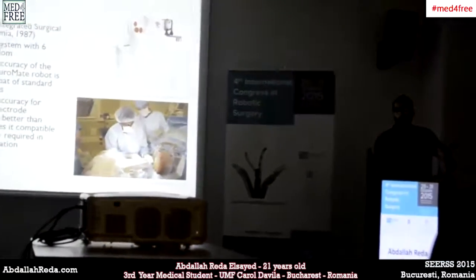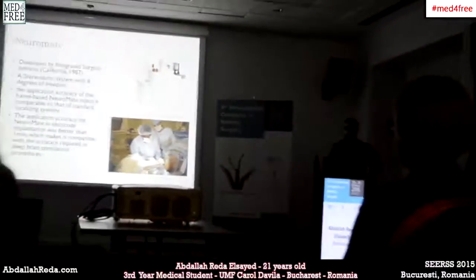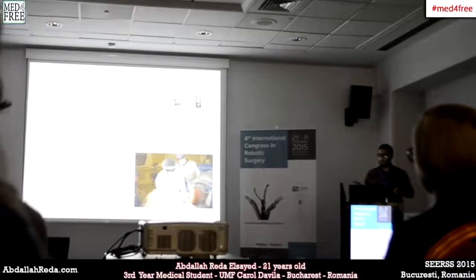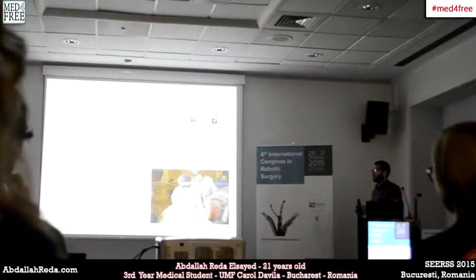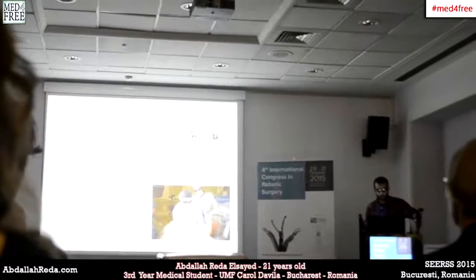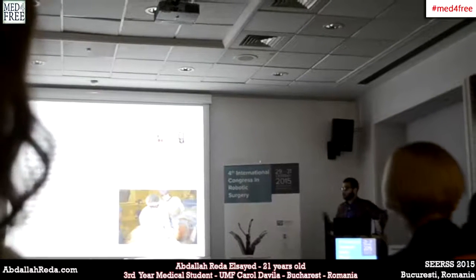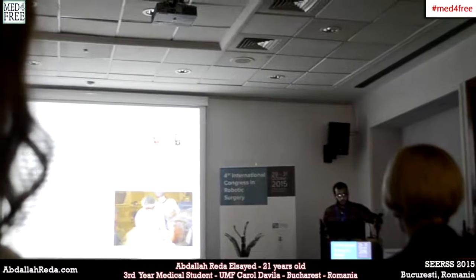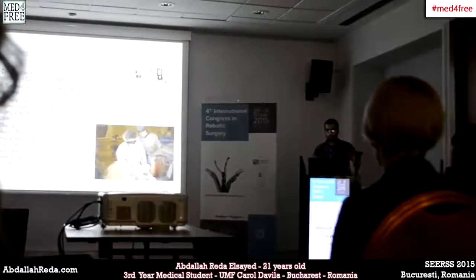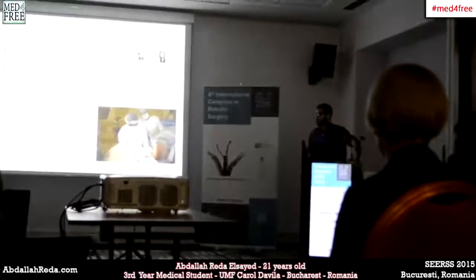So I'd like to start with Neuromate, which was developed in California in 1987, which is pretty interesting. So it's not pretty recent. Since the peak of the advancement in robotics, that idea came to mind, to use robotics in such a very precise operation. It's a stereotactic system with 6 degrees of freedom, and it's pretty interesting because the frame-based Neuromate robot's preciseness is comparable to that of standard localizing systems, and the application accuracy for Neuromate in electrode implantation was better than 1 millimeter, which makes it suitable for electrode implantations and deep brain stimulation procedures.